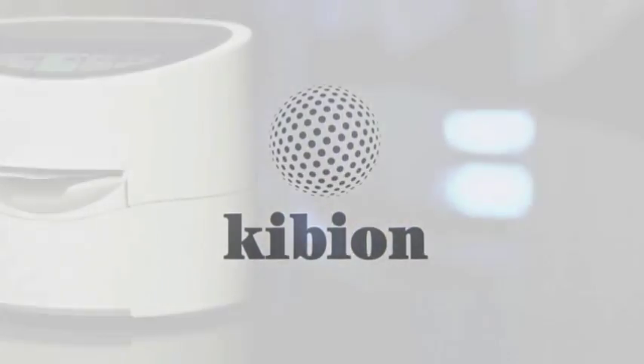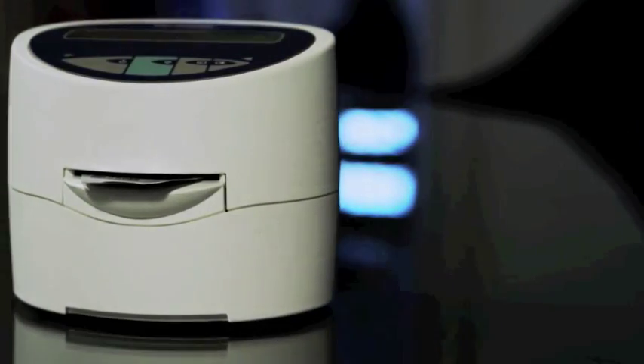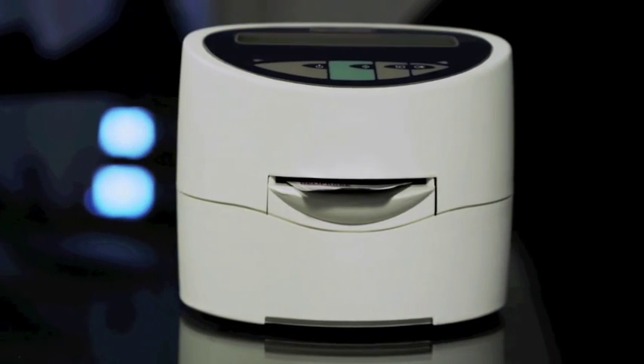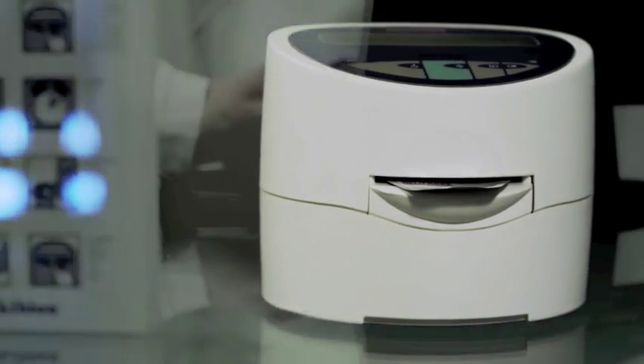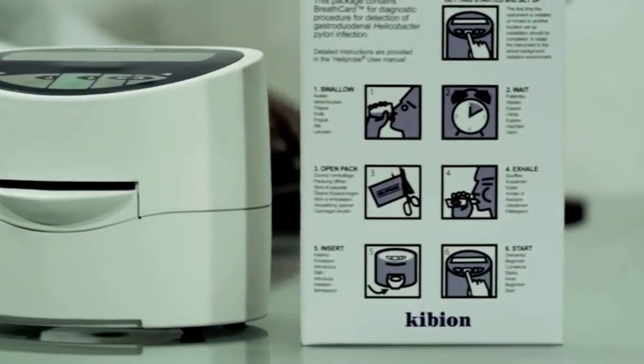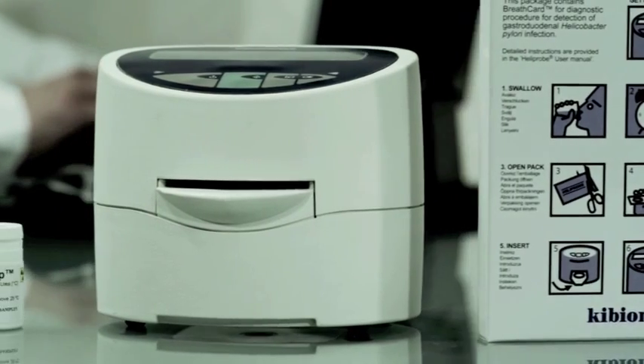The Heliprobe system is a diagnostic tool from Kibion that can help you confirm or rule out Helicobacter pylori infections. The procedure is non-invasive, painless, and it takes just 10 minutes. Here's how it works.